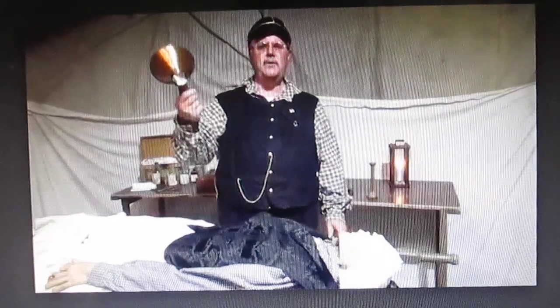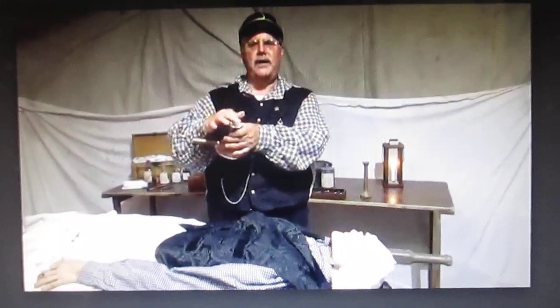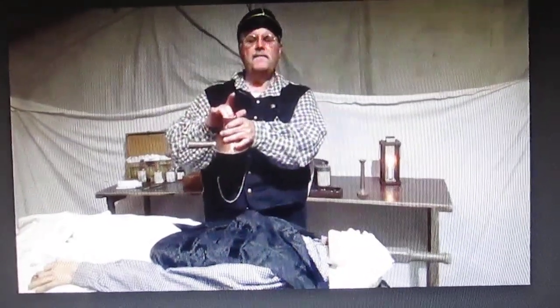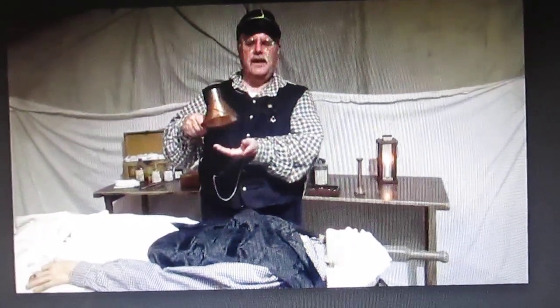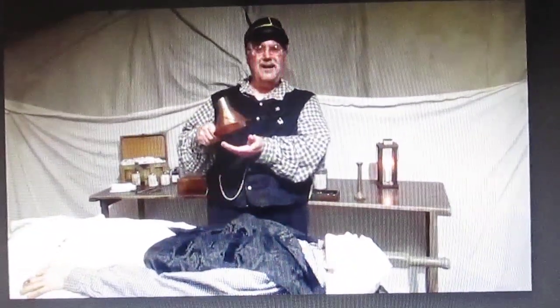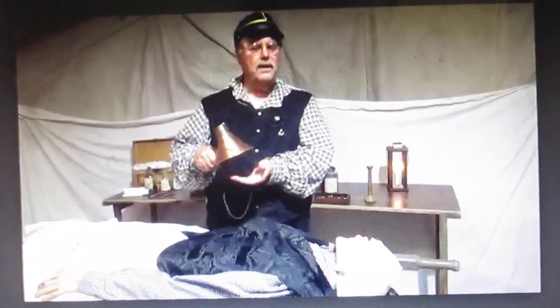So the first thing we're going to do is we're going to take our ether cone, and you'll notice it has a large area here and a small area here. We're going to drip some ether or chloroform in here and place this over the person's face. It'll turn from a liquid to a vapor, and as a result, they will go to sleep. Now, normally this takes somewhere between 9 and 12 minutes, so we're not going to take quite that long.